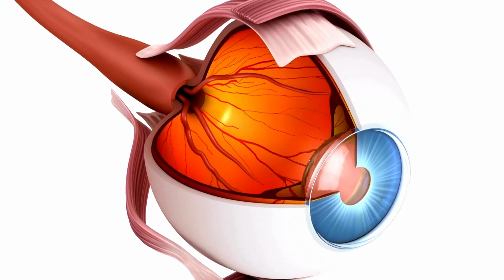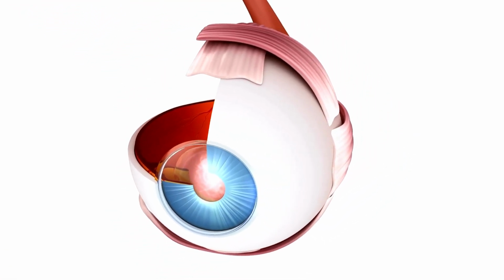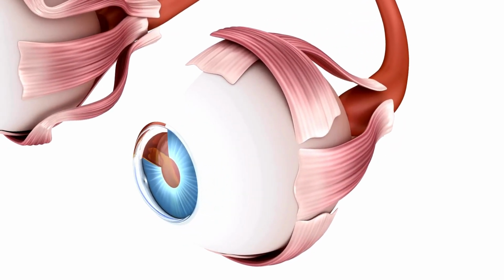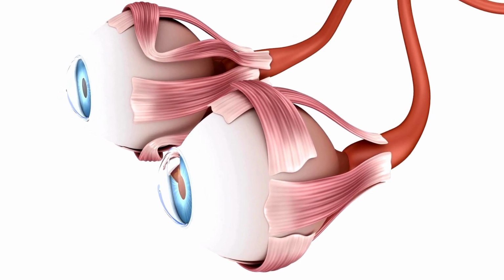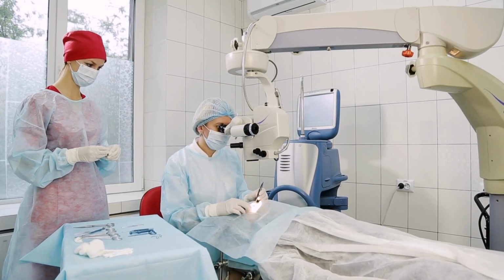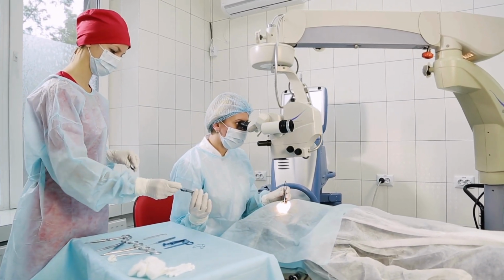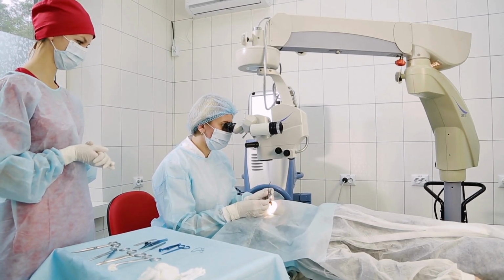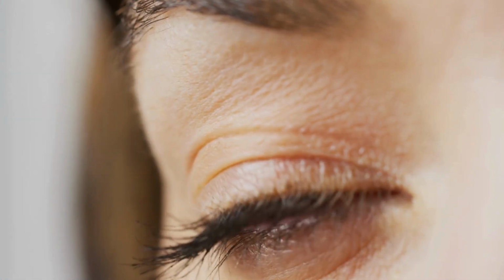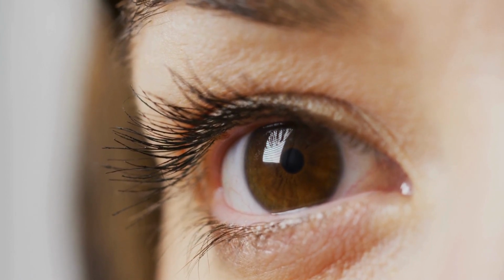Not everyone undergoing cataract surgery develops posterior capsule opacification. Between 20% to 50% of individuals may experience it within 2 to 5 years after cataract surgery, particularly in children. Symptoms of posterior capsule opacification are like those of cataracts. If you experience a recurrence of cataract symptoms, contact your ophthalmologist for a slit lamp examination.